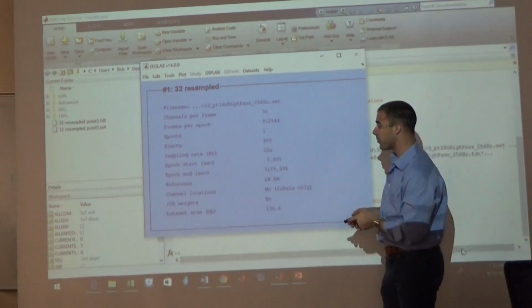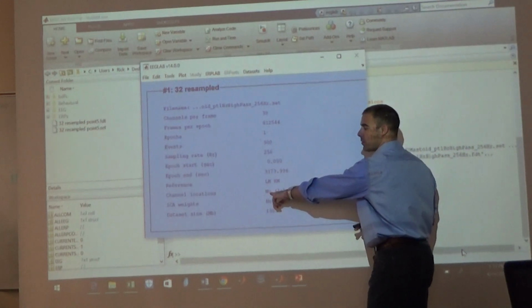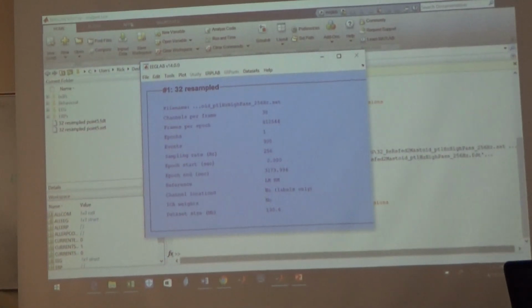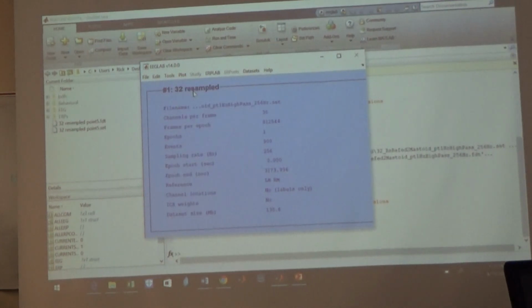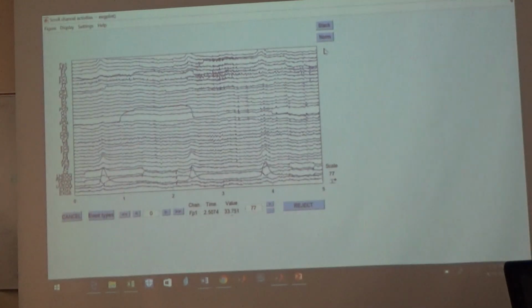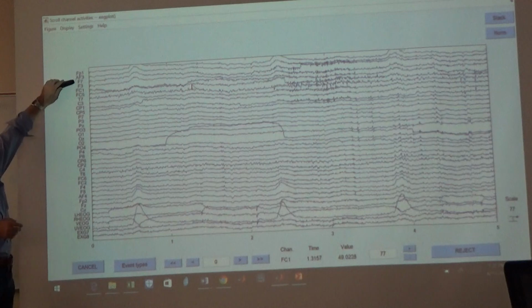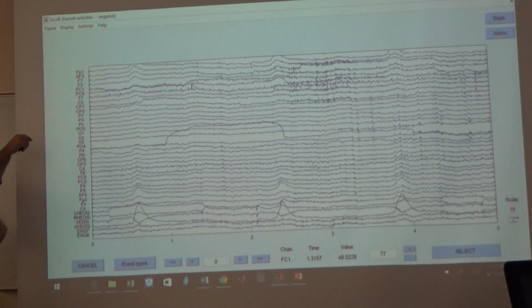It tells us one thing right off the bat, that we do not have channel locations labeled. Okay? So, let me just show you a little bit about what that might mean for us. So let's go to plot channel data scroll. We'll bring up the data. Okay? Now we can see that it tells us all these features of each of these EEG traces, of what site they're from.